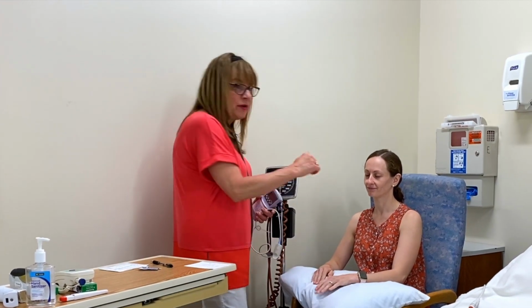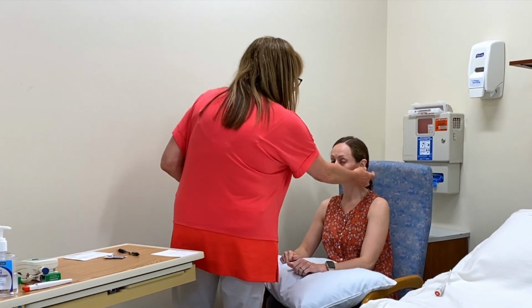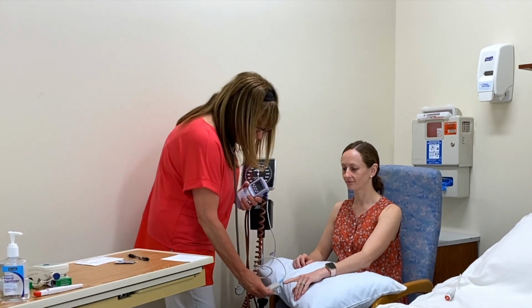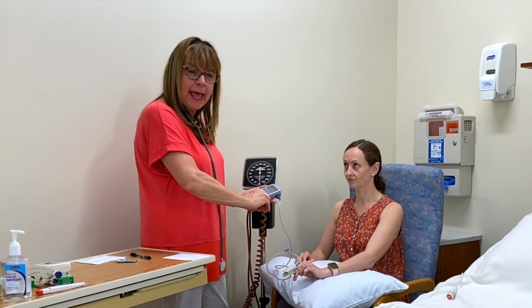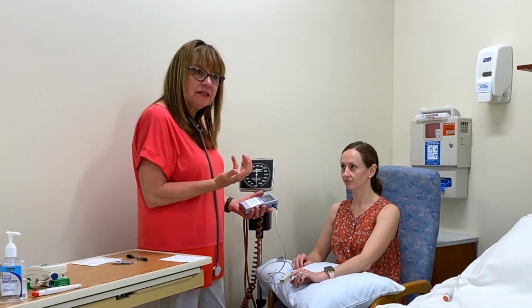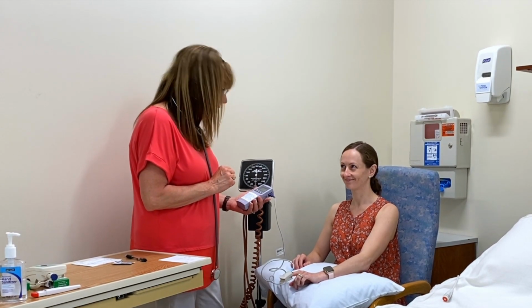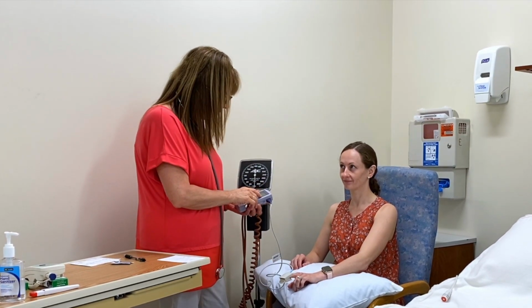There are other ways that you can measure SpO2. You can also measure it on the earlobe, sometimes on the great toe. I'm going to measure it on her finger here. The light goes over her finger. There's a beam that's bouncing down into her vasculature, and it's going to measure the percent of oxygen that's on her hemoglobin molecule. And Monique's perfect. Her SpO2 is 100%. And it's saying here that her heart rate is 75.